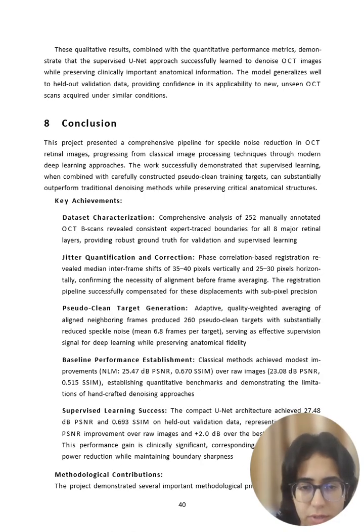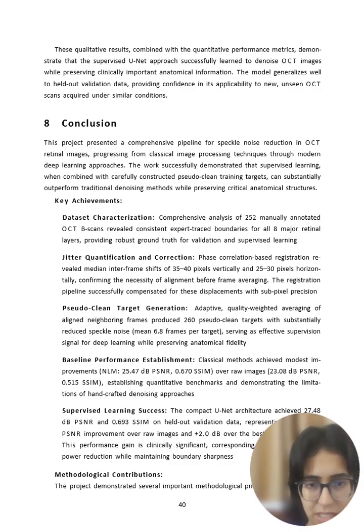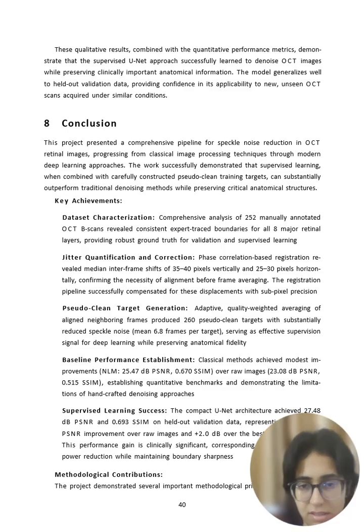So we can conclude our project that we have successfully reduced speckle noise in OCT images, progressing from classical image processing techniques to modern deep learning approaches. The work successfully demonstrated that supervised learning, when combined with pseudo-clean training targets, can substantially outperform the traditional denoising methods that are present.